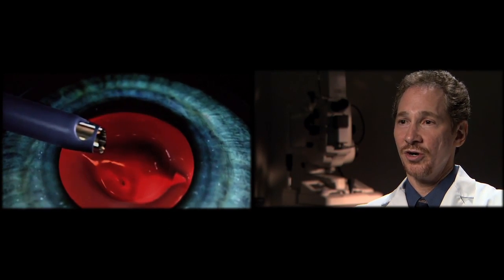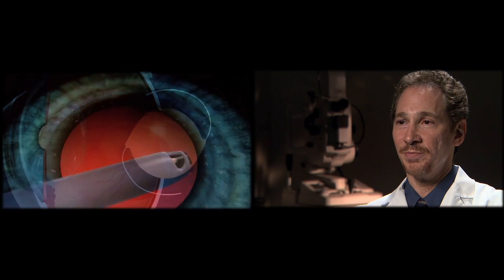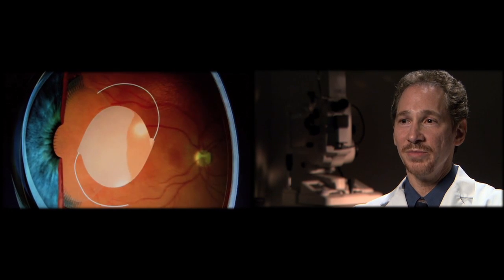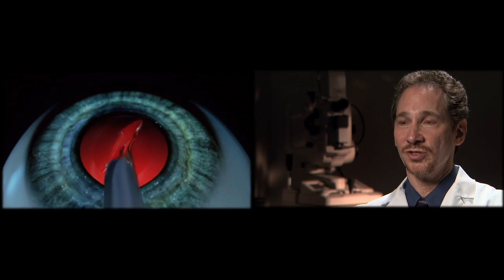The actual surgery itself takes under five minutes and it doesn't hurt at all. People don't see instruments come towards their eye. A lot of the things that people are afraid about don't actually exist. The eye itself is numbed prior to the surgery, so there isn't any discomfort during the surgery.